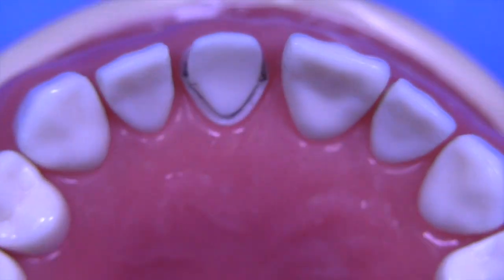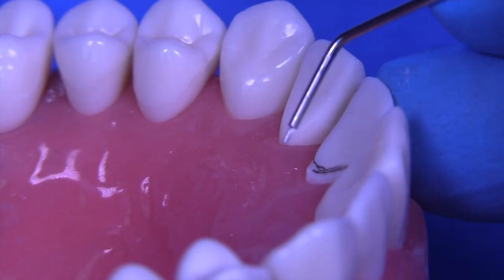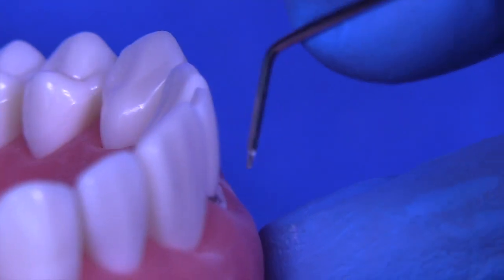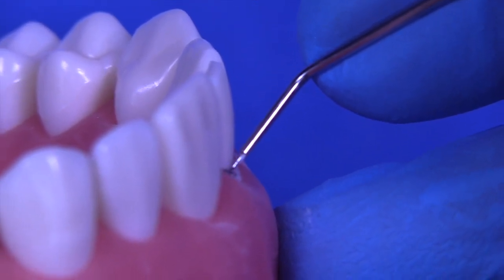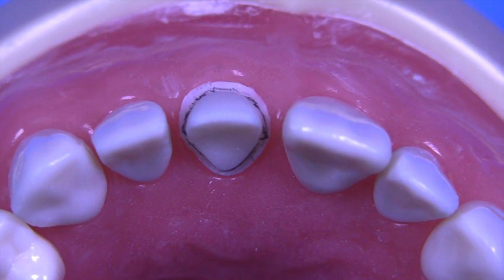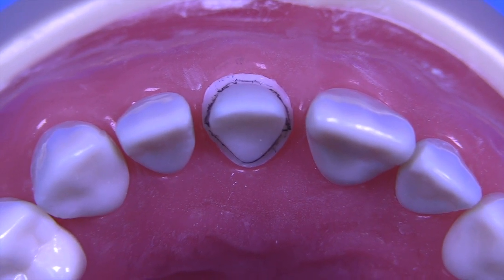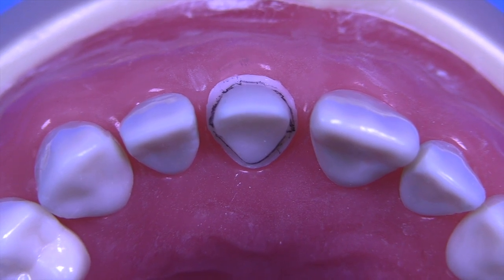Mesial distally, you're okay. So sometimes the problem is that your lingual wall is too upright, which I don't think it is. I think you've leaned your lingual wall towards the facial. The problem in your case is this bulge here in the middle of the prep is hiding that margin. So if you were to remove this bulge, as we mentioned in view number 3, we would be able to solve that particular problem. Can we still make a PFM here? Absolutely. The laboratory will have to block out the undercuts so they can fabricate the crown, but it can be done. Let's take a look at the lingual.